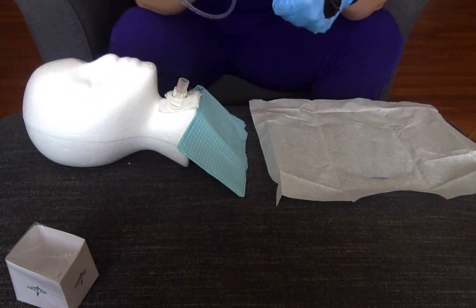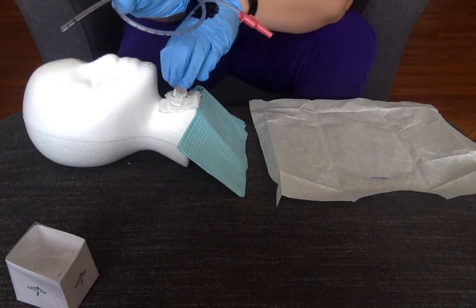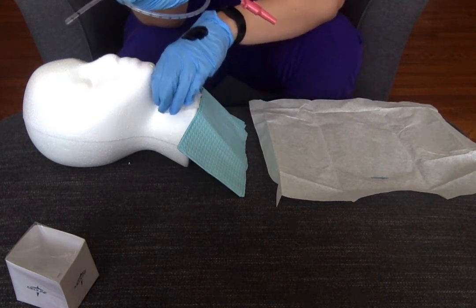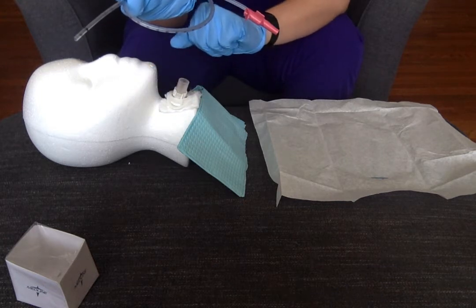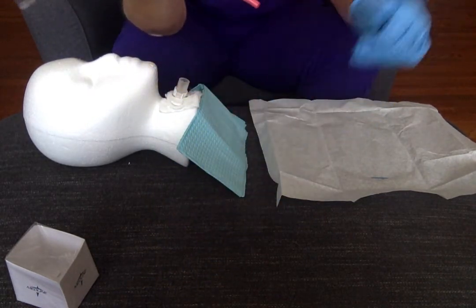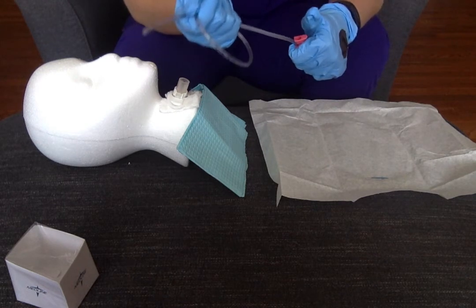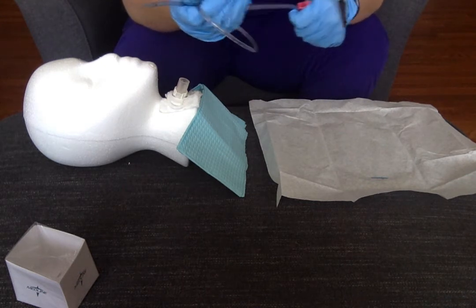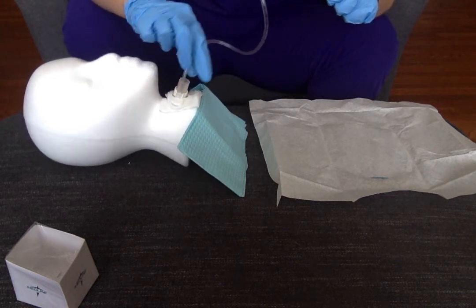I'm going to coil this around my hand again to keep control of it. Typically your patient will have oxygen on — we usually hyper-oxygenate them before the procedure. In this instance, we're going to pretend they just have a trach collar, which is almost like a simple face mask designed to go over the tracheostomy tube. Maybe I turned it up to 15 liters to hyper-oxygenate them while preparing. So I'm going to go ahead and remove that mask with my dirty hand, since the dirty hand can touch the patient. Then I'll get control of my valve and start feeding this tube down into their tracheostomy tube.